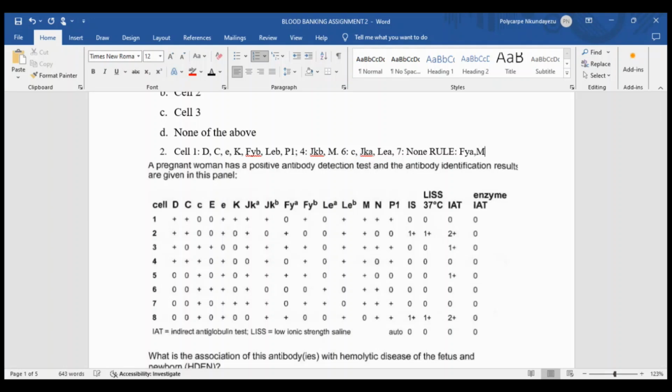And M, capital E, and capital N, right? This capital N. Okay, so why? Because like what she's talking about, we have to look at all the antigens on top here, and try to compare them with what we already excluded from the panel.